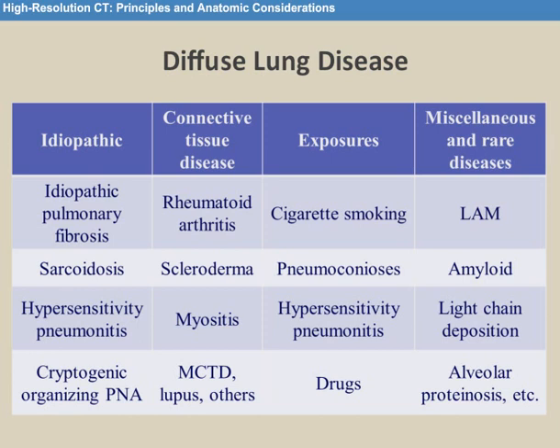When you're listening to the clinicians and there's no exposures, HP is still definitely on the table because approximately 50% of patients with hypersensitivity pneumonitis do not have an identifiable exposure. And you may be the only one to distinguish HP, in particular, HP from IPF. The radiology is actually quite suggestive of HP in particular cases.